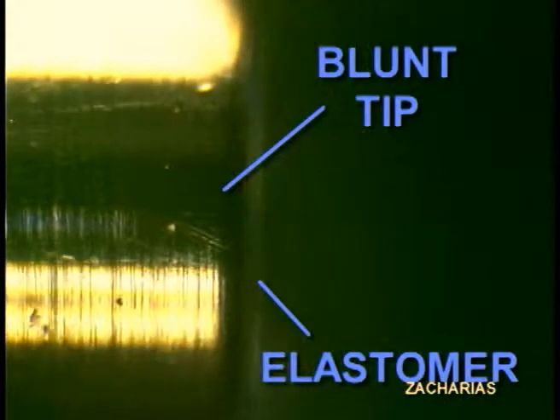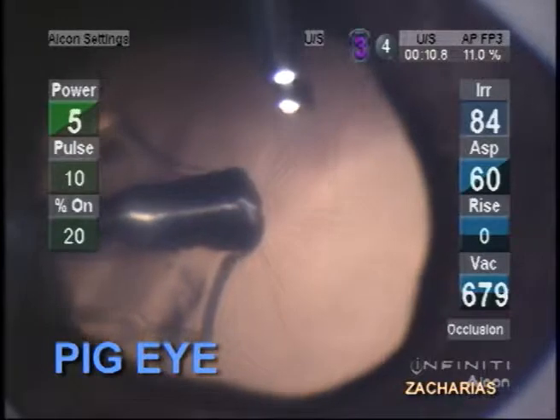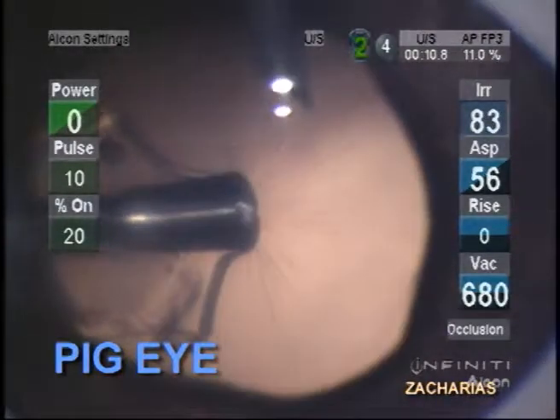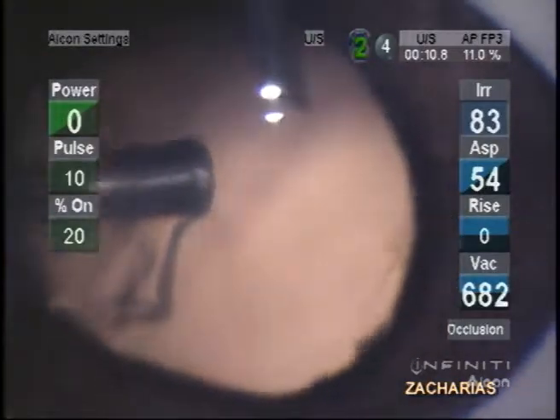Using a special slow-motion recording technique, we were able to determine that an elastomer-capped, blunt phaco tip was able to adequately emulsify relatively dense cataract material using low US power. We also demonstrated in the animal eye that this elastomer-capped phaco probe was friendly to the capsule in the same way silicone-covered IA handpieces are, even when ultrasound power was applied.